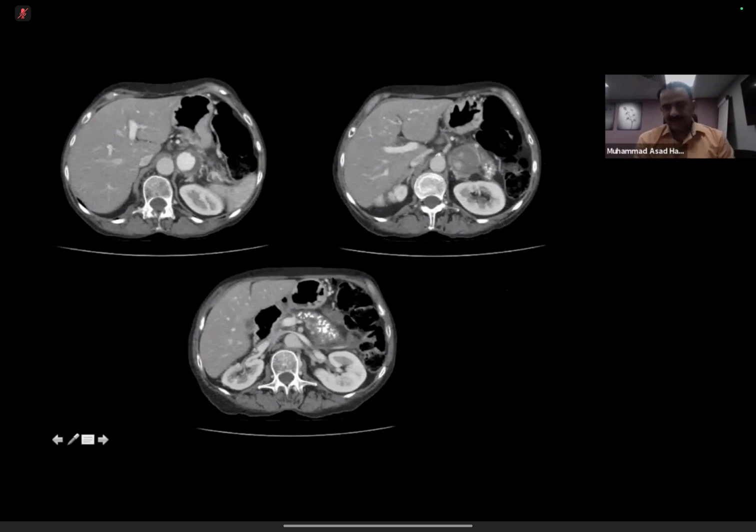For all the other candidates who are observing this, once you describe that there is calcification within the pancreas, it basically points to chronic pancreatitis. Once you identify chronic pancreatitis, you should be looking for different complications, whether the patient has a cyst, which is one of the common complications, or an aneurysm. Some visceral vessels go very close to the pancreas, especially the splenic artery, and splenic artery aneurysm is a very well-known complication of chronic pancreatitis. How do we treat them?